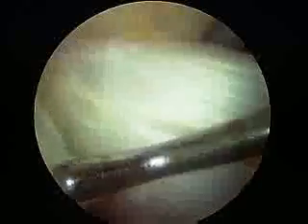So this is just synovium. This thing here is synovium. That's the lining of the knee joint, and there's no blood or anything to indicate that that's torn. There's the femoral attachment of the anterior cruciate ligament.